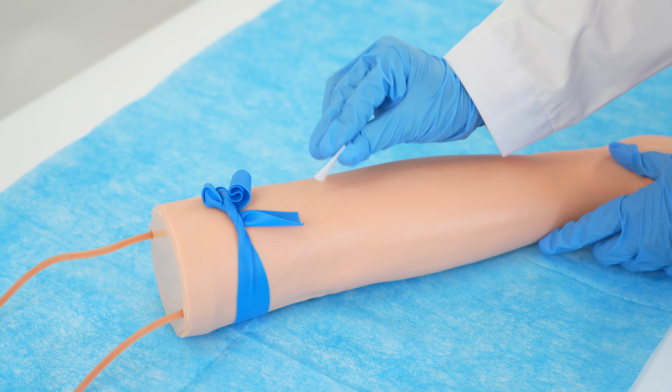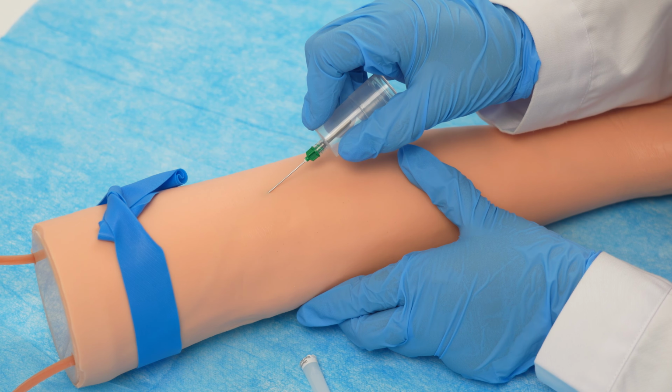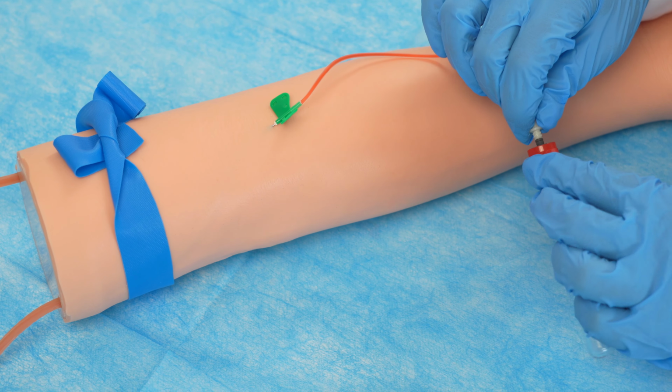Once the arm is adjusted, clean the site with an alcohol pad and draw blood using the phlebotomy needle. Repeat the practice with all 3 vein positions, focusing on accuracy and technique.